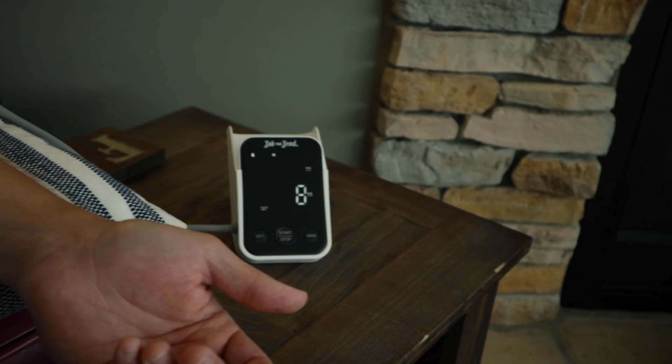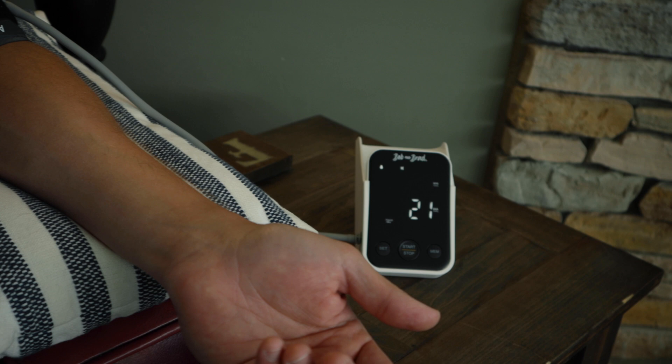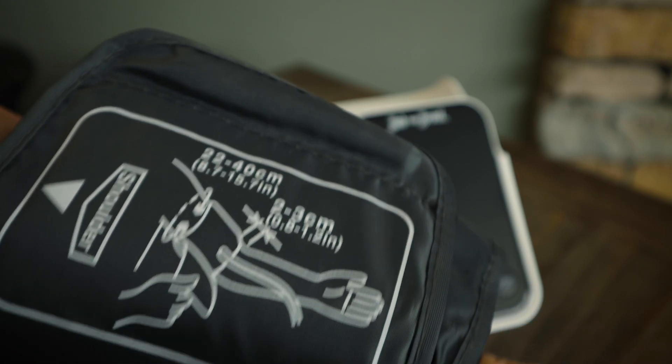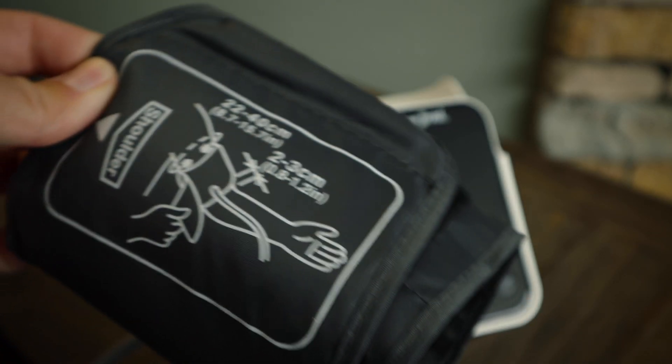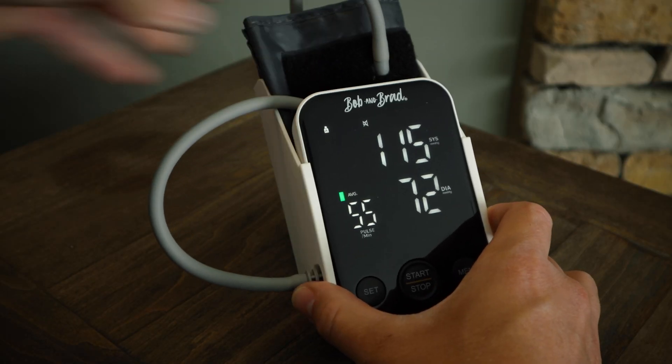Are you trying to find a good quality blood pressure monitor so you can take your blood pressure at home? Today I'll be reviewing and demonstrating how to use this brand new home blood pressure monitor by famous physical therapists Bob and Brad. At first glance this device looks like one you would see at your local drugstore or a doctor's office, and that's because it's designed with simplicity in mind and built to provide high quality accurate readings, which is important as you monitor your blood pressure at home.